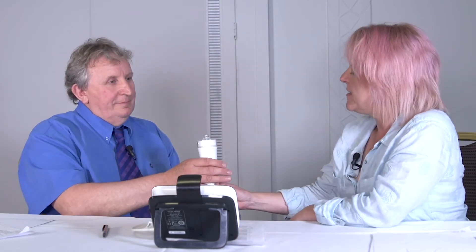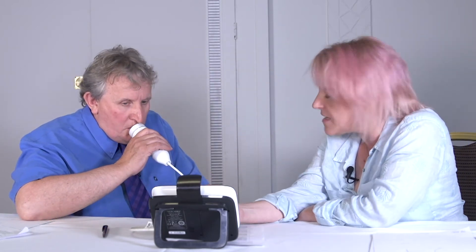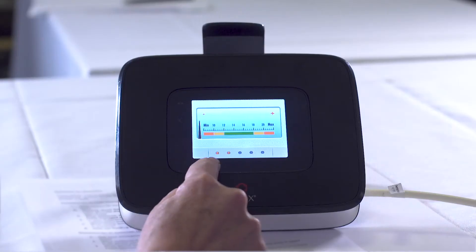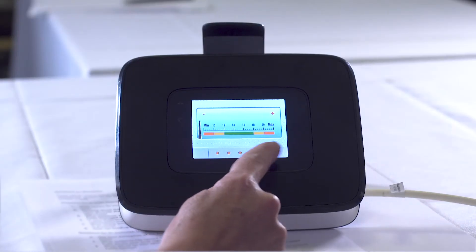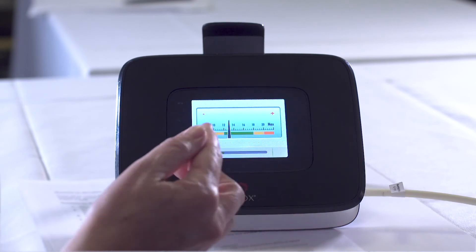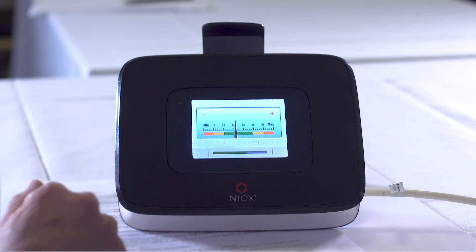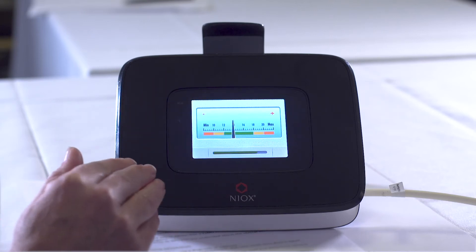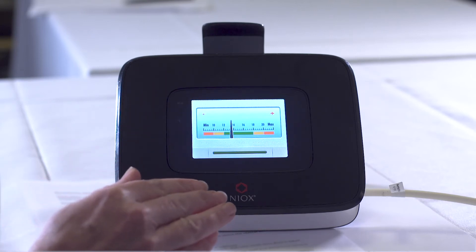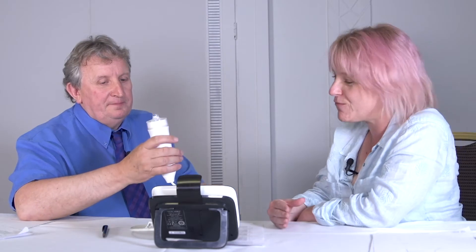So hold this. I want you to breathe out and empty your lungs — and now put it to your mouth and suck. Keep breathing in. You can see these are filling up. Right, now it's full so I want you to push — breathe the air out a little bit harder. A little bit harder. Fantastic. So that's a nice steady tone — keep it there in the green. That's nice and steady. Beautiful. Now that means that the test is complete.